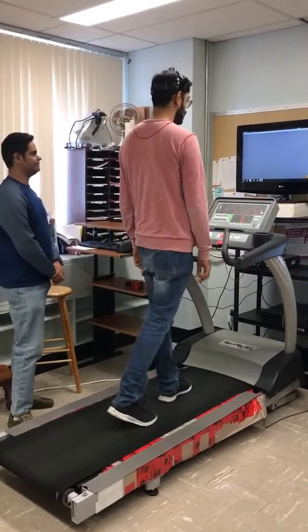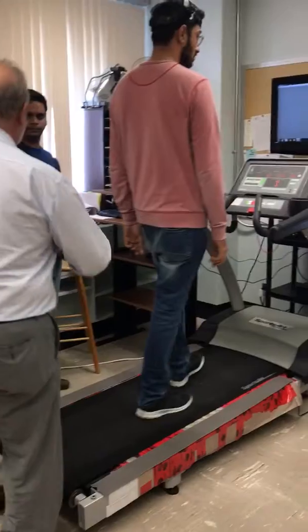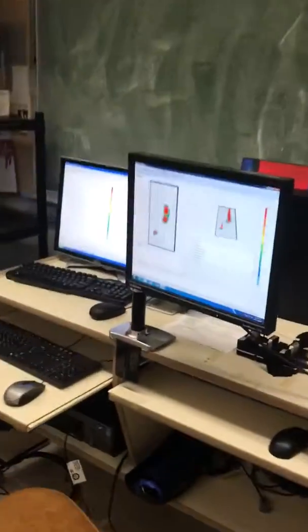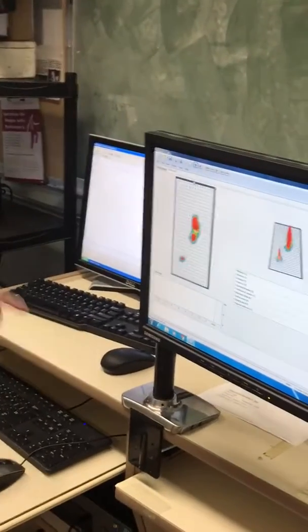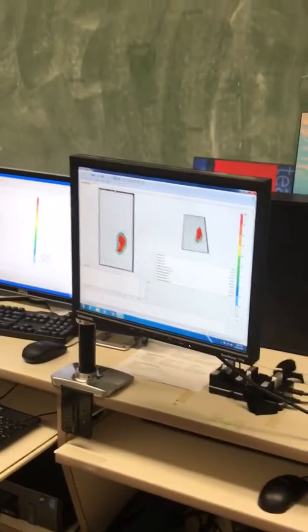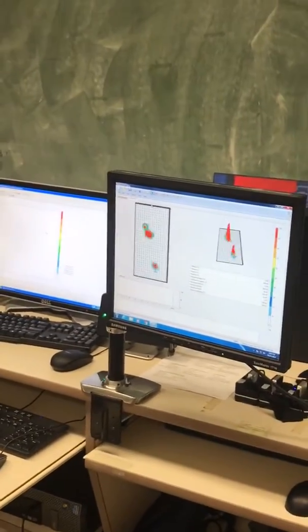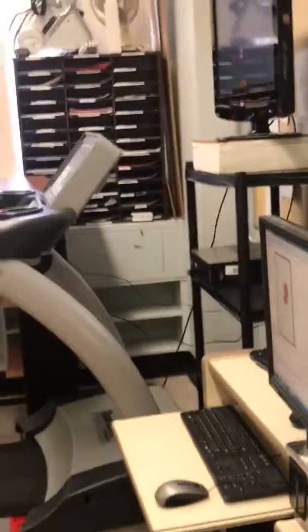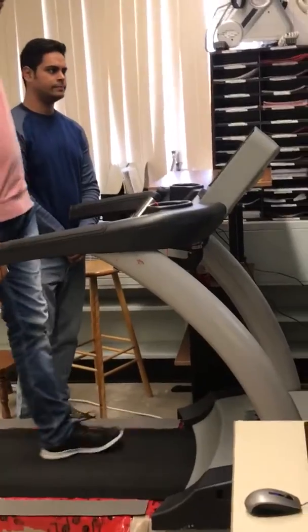And here we go. So now you're using your sensor on your head while you walk, with the gait and cadence. This is pretty neat, actually. Is the FSA going? There you go. So we're getting those footprints. So what can you tell from that heel strike that is of interest to you?